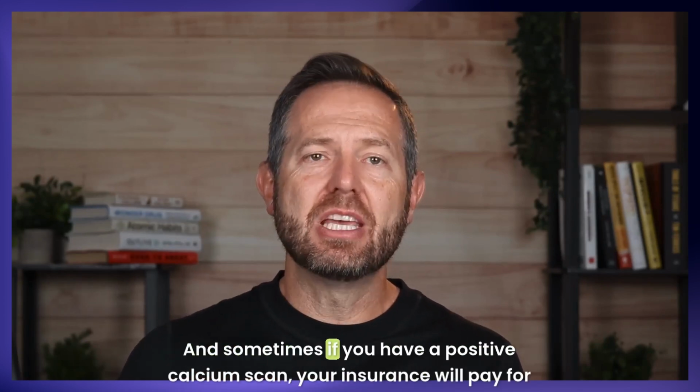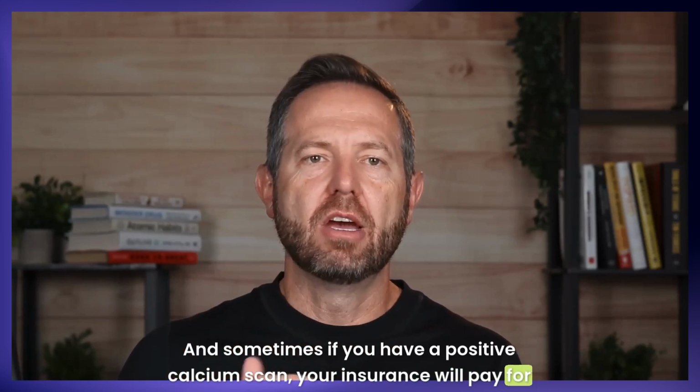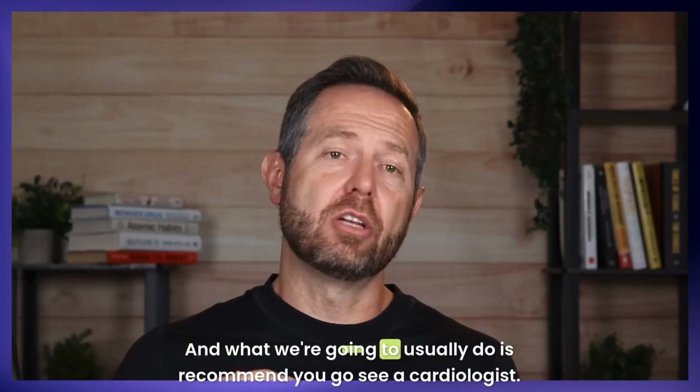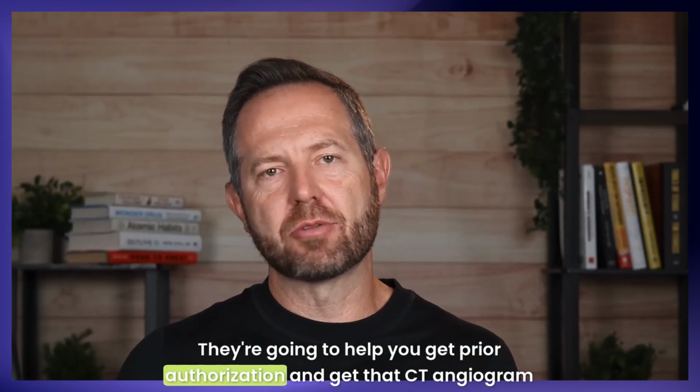And sometimes if you have a positive calcium scan, your insurance will pay for a CT angiogram. And what we're going to usually do is recommend you go see a cardiologist. They're going to help you get prior authorization and get that CT angiogram done.